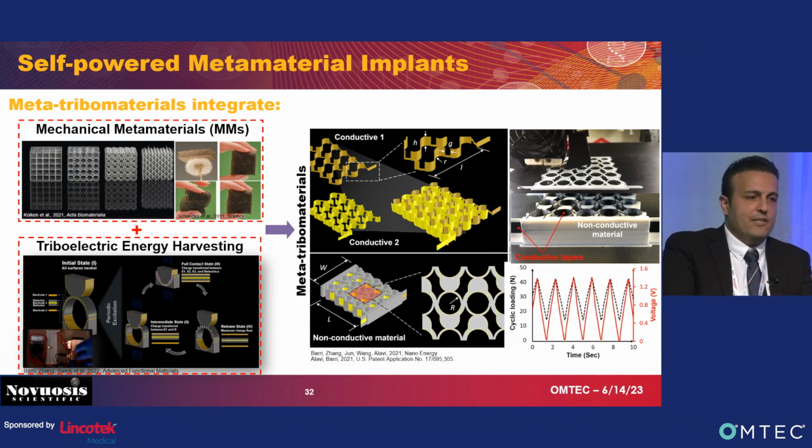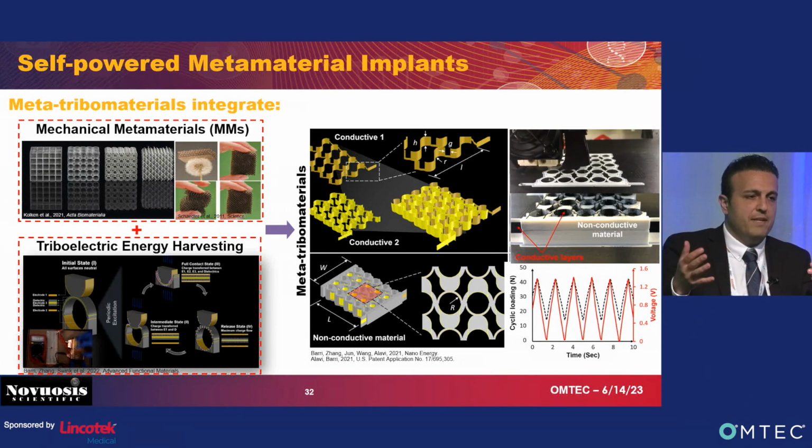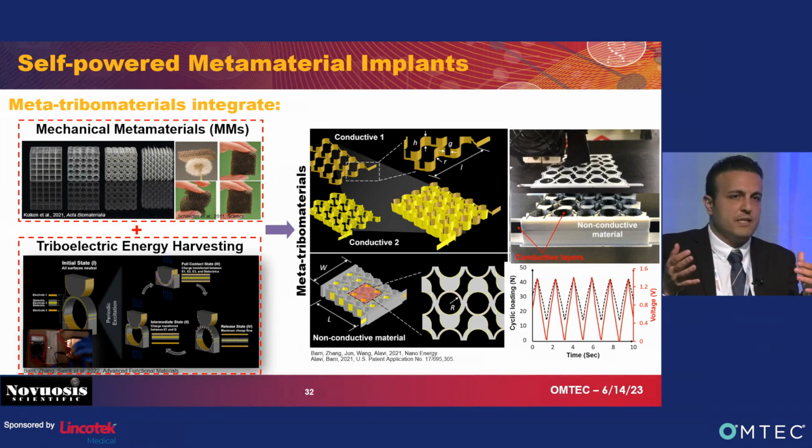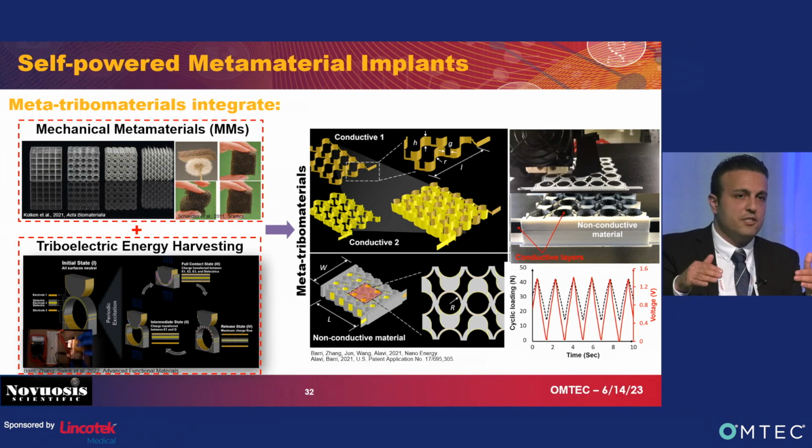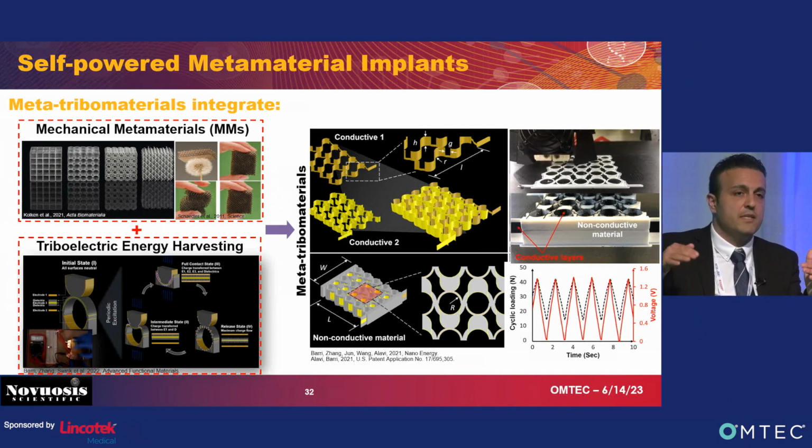There's an example, you can see in the video, of how we can create energy. The type of nano energy harvesting system that we are using is triboelectric nanogenerators. I'm sure you have experienced triboelectrification, but let me explain what we mean and how we do it. Triboelectrification is contact electrification. When you rub a balloon on your hair, you notice that spark, like it's creating 2,000 volts. It doesn't hurt us because the amperage is so low.